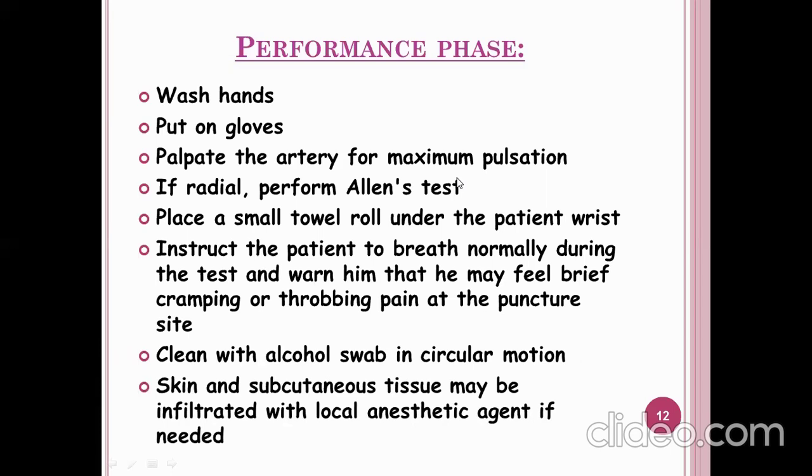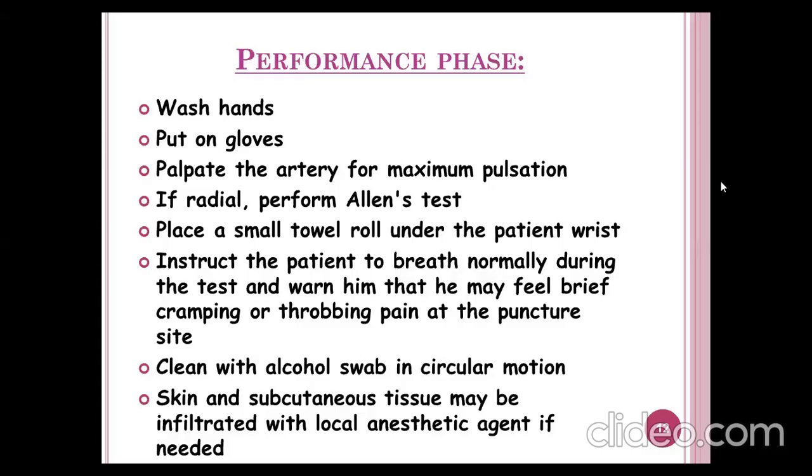If the patient is worried or quite feeling pain, we have to use a local anesthetic agent in consultation with the anesthesiologist. Otherwise, if the patient doesn't need it, there is no need. So that was the performance phase.